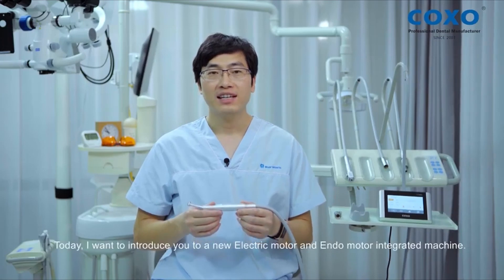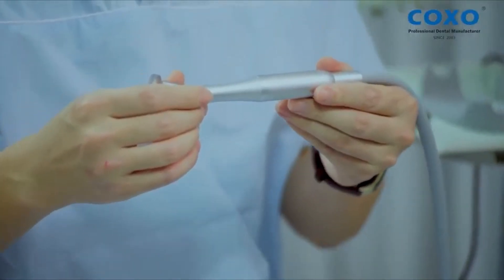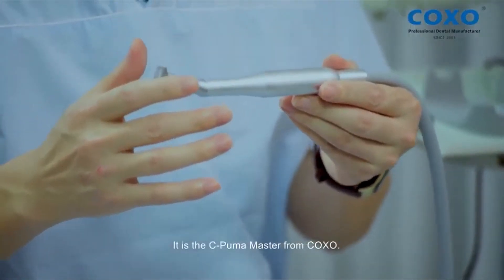Hello, everyone. I'm Dr. Yu Gong. Today, I want to introduce you to a new electric motor and endomotor integrated machine. It is the C. Puma Master from COXO.